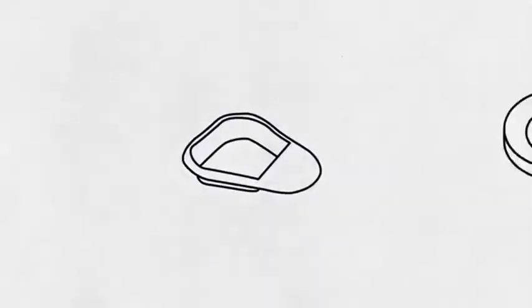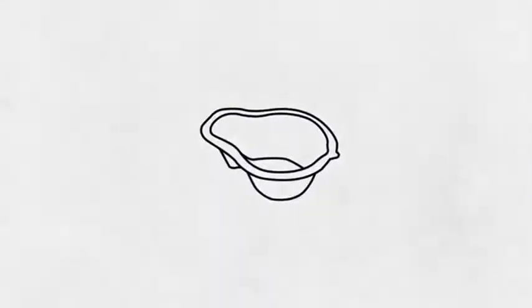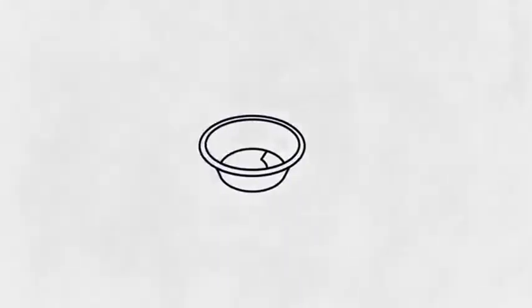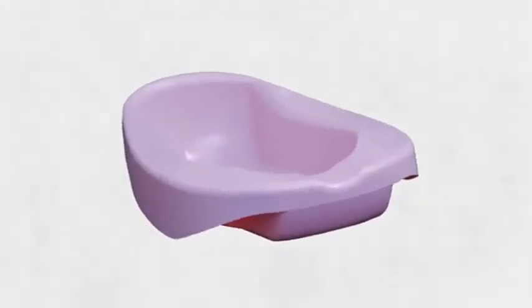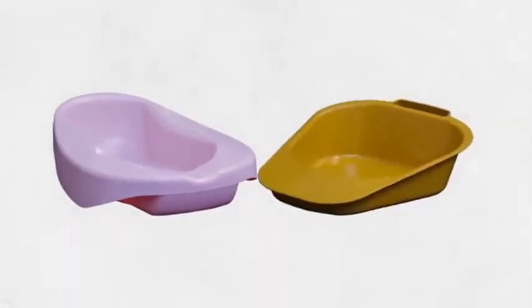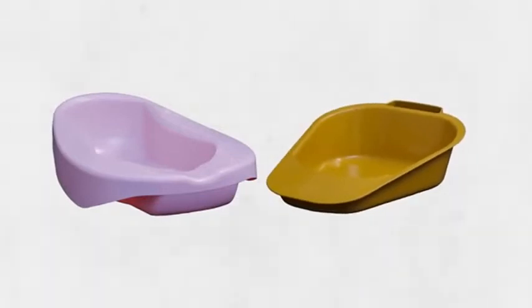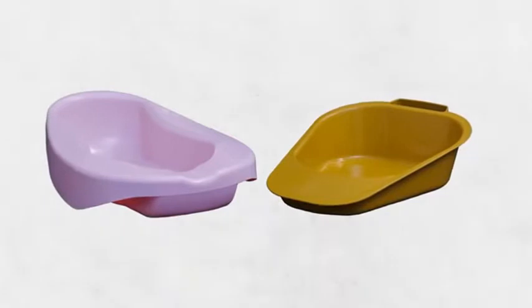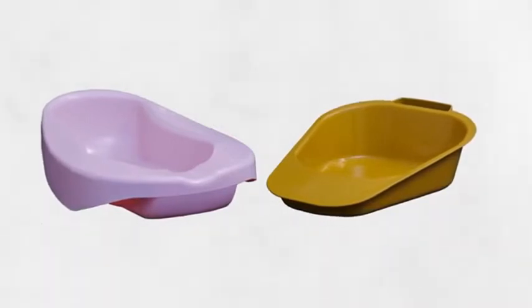A bed pan is a portable container that allows someone to urinate and have a bowel movement without leaving their bed. Bed pans come in a variety of shapes and sizes and can be made of metal or hard plastic. The most common types are the standard bed pan, which is contoured to fit comfortably under the person you're caring for, or a fracture or slipper pan that is wedge-shaped. This type may be easier to slide under someone, especially if they have broken bones, missing limbs, or paralysis.